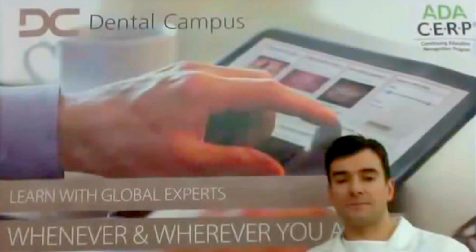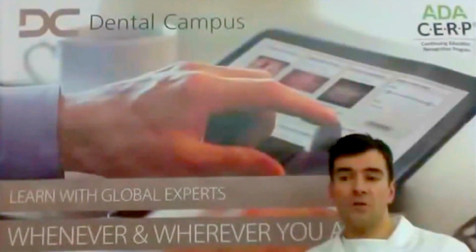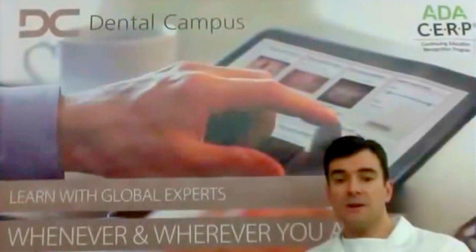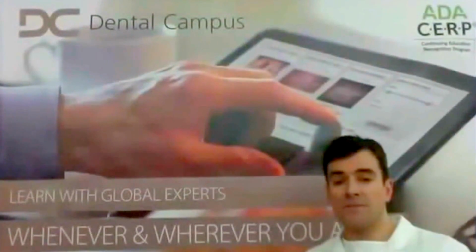So what are the indications to perform socket preservation? The indications to perform, I'm going to call it ridge preservation, are basically 2. In the anterior region, we want to keep the volume of the tissue.